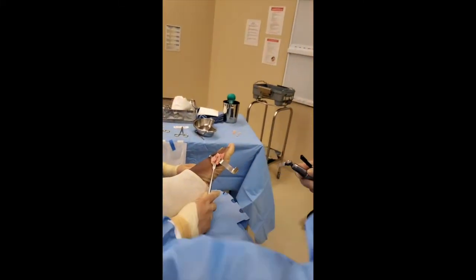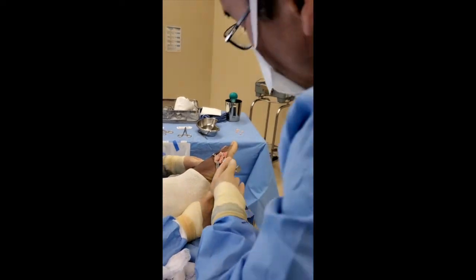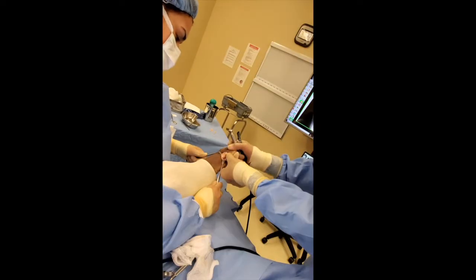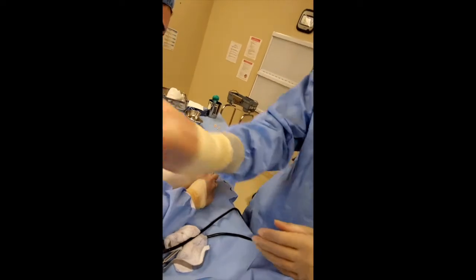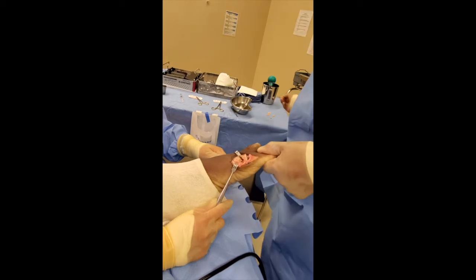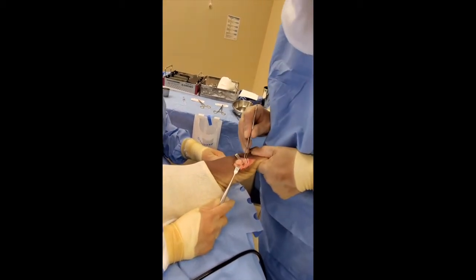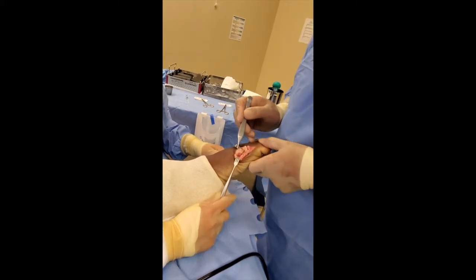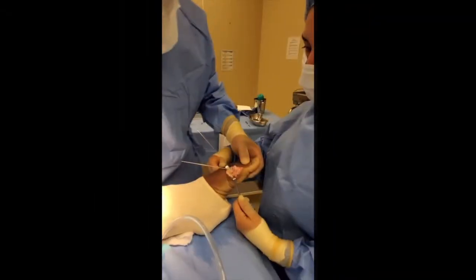I'm going to take a wedge of bone out from the top here. Now we're going to remove that symmetrical wedge of bone. There it is — a wafer-thin piece of bone. That's going to shorten this bone, bring it down and back, and give it enough room to go up and over to increase the range of motion. Now we're just going to screw this back together.